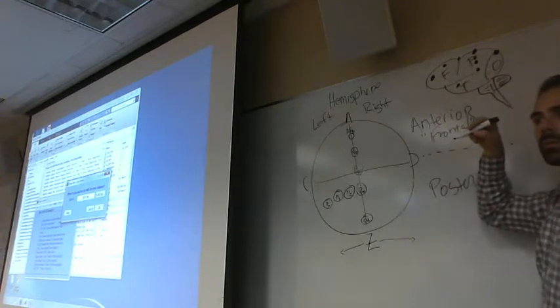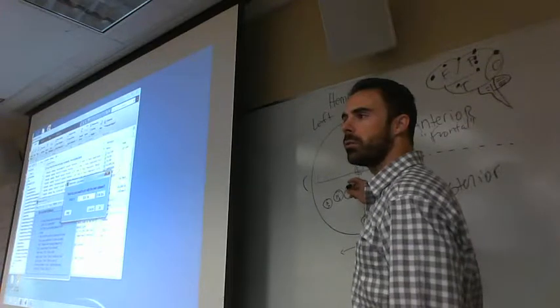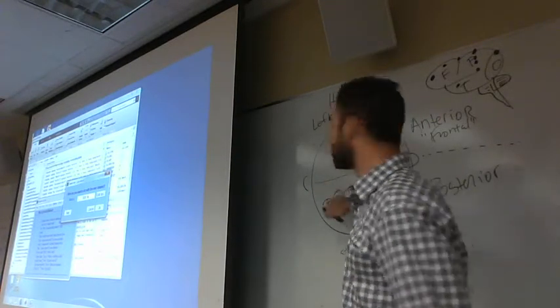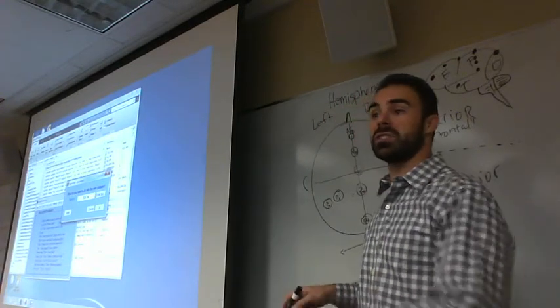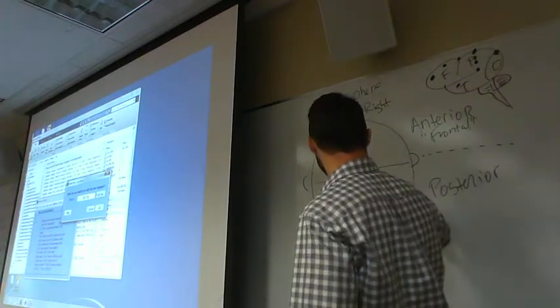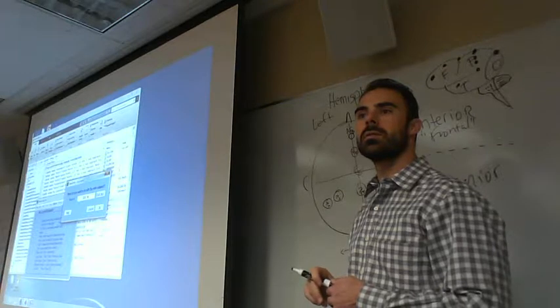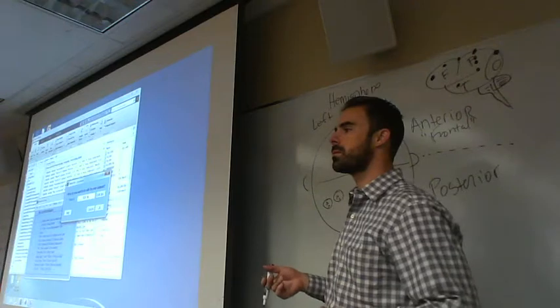See how it's mapping? So what this is telling us is we basically have our odd numbers, 1, 3, and there could be 5 there too. The electrode sites we usually use don't use 1. They just do 3 and 7. But conceptually, you could use more electrodes and put the numbers in there. Same thing here. This might be P4, P6. Right is even. Pretty simple, right? So there's a method to the madness.